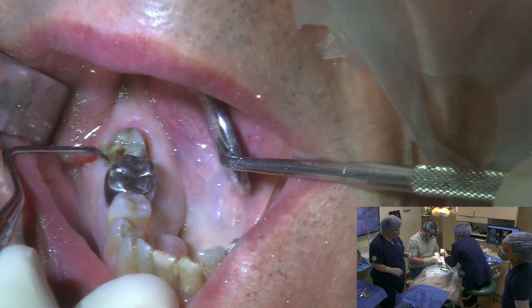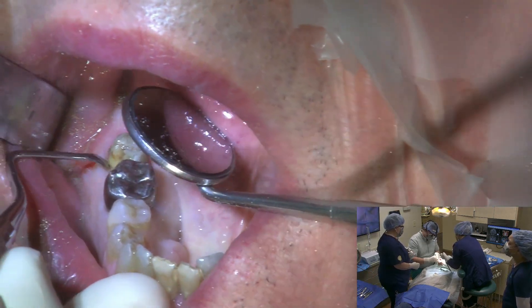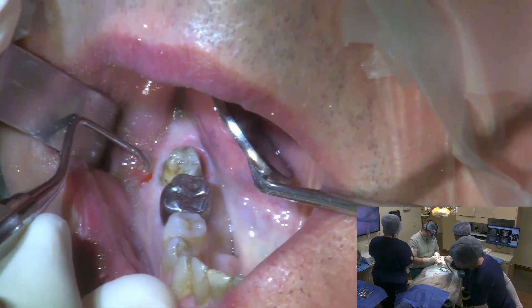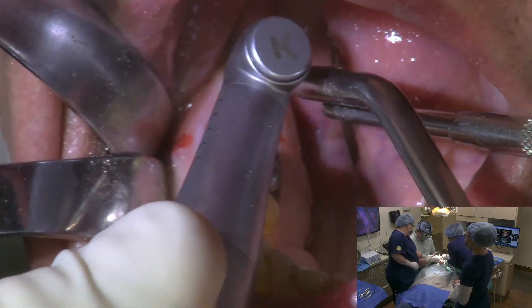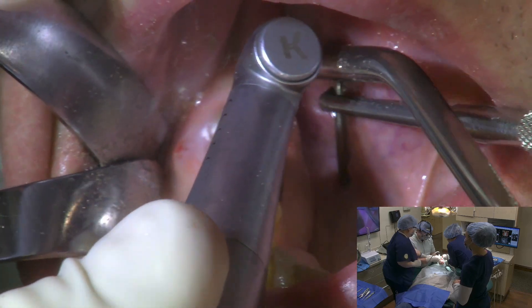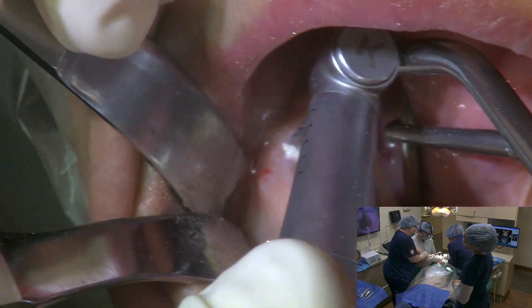Section right there. Just going to section the tooth in a couple of different pieces here. Can I have you just turn to your left just a little for me?